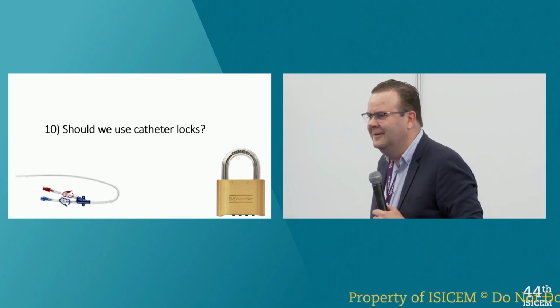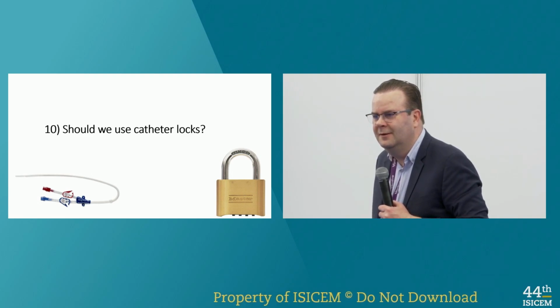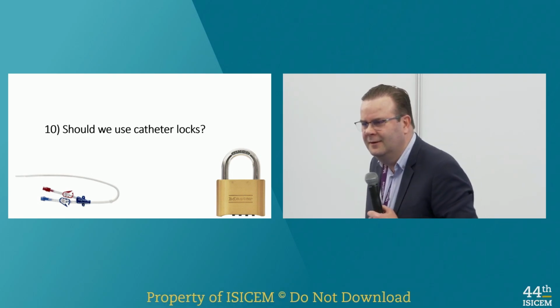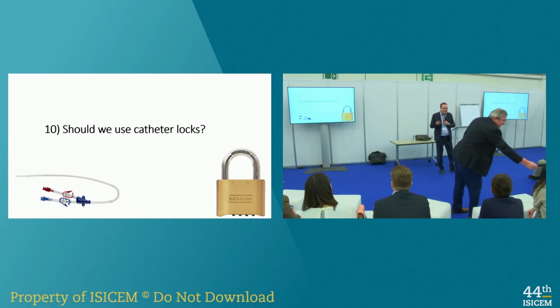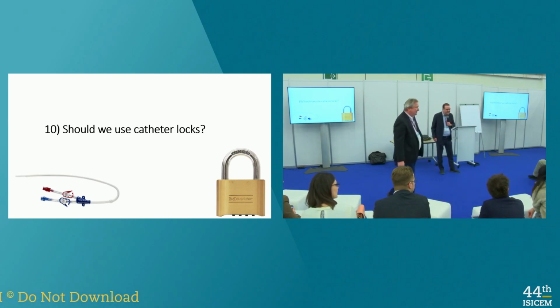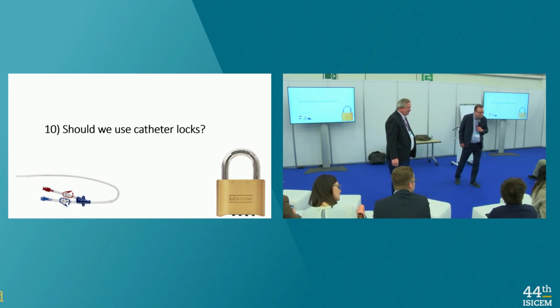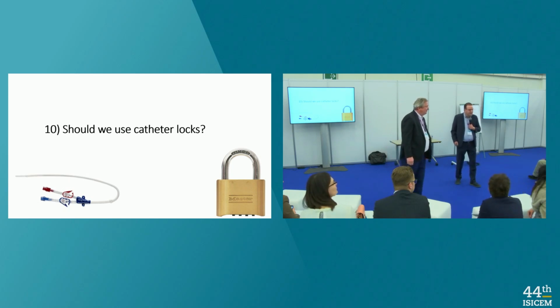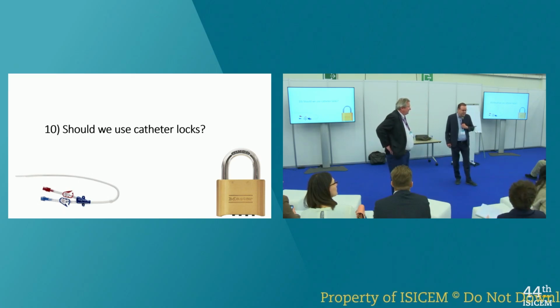So citrate, heparin, saline. We also use citrate. That's a very good point. I think it's important to place a citrate. It depends whether we start the hemodialysis soon or we will postpone it later. Let's imagine you send your patient to the theater for surgery, like for 3 hours, 4 hours.